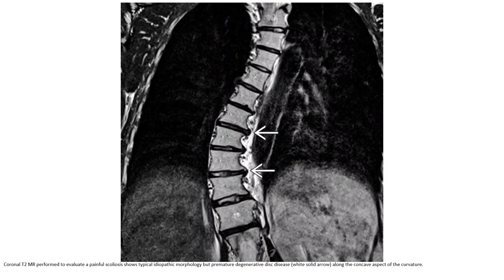T2 MRI performed to evaluate a painful scoliosis of atypical idiopathic morphology shows premature degenerative disease along the concave aspect of the curvature.